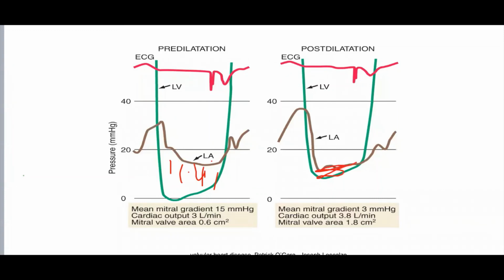Look, now see here, the V wave has increased a little bit. Right? Why is that? Because of MR. Yes, MR, most likely, exactly. Most likely, they have induced MR.